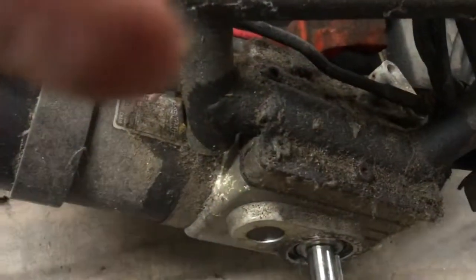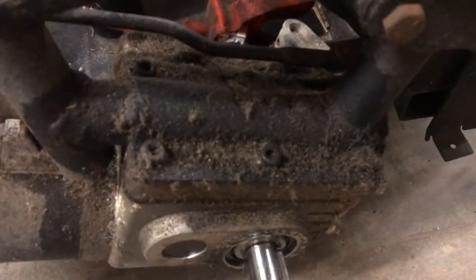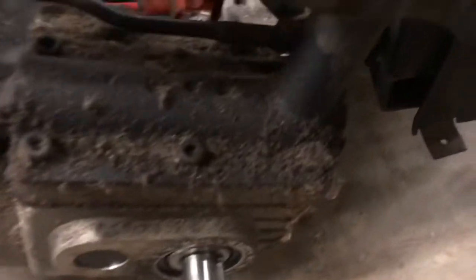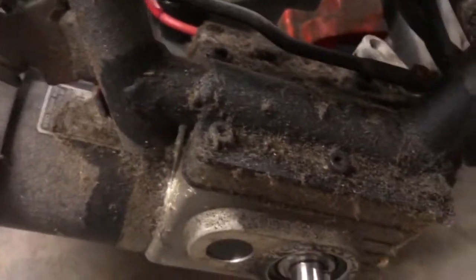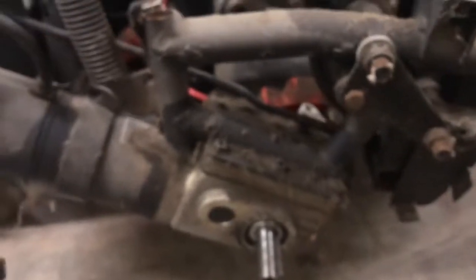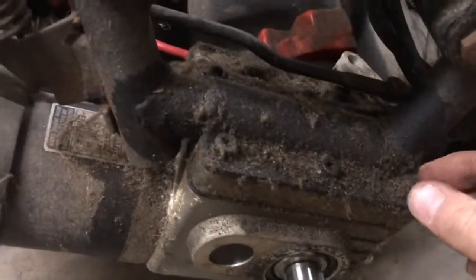Another problem, you don't want to strip these Allens, and as you can see here, there's usually a lot of dirt and debris. So you may want to get a small Allen or a Q-tip, wet it, and go in there and clean these out, because if your Allen barely goes on there, it's pretty much guaranteed that you're about to strip it. So you want to make sure to clean any clogs out.